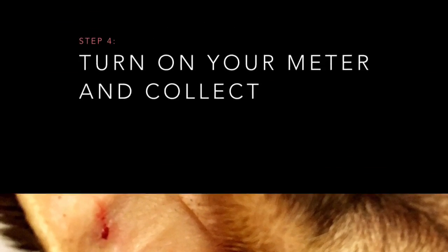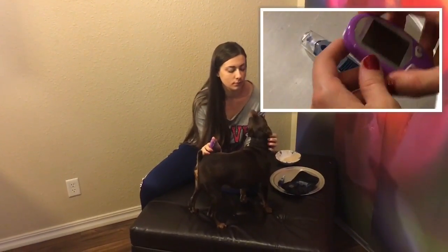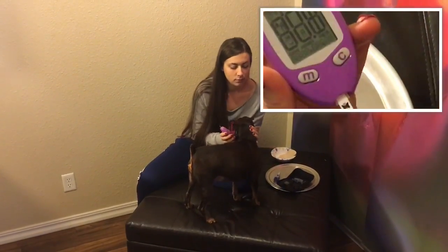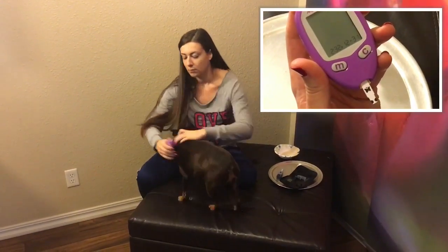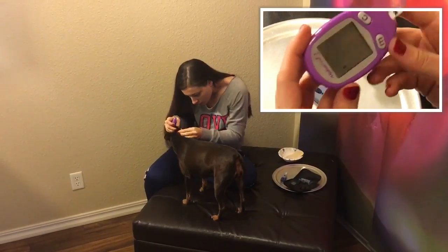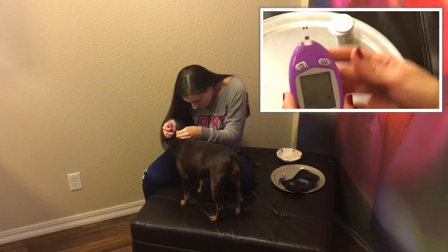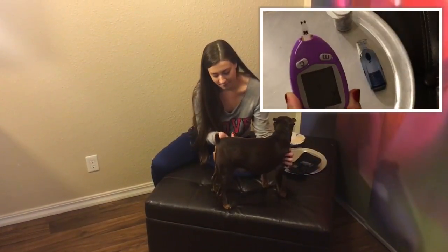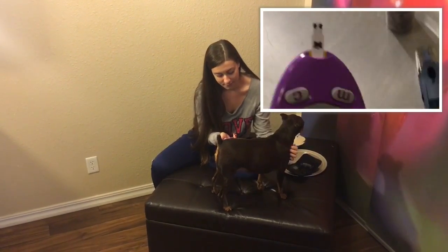Sometimes the blood doesn't show up right away, and it takes about 15 to 20 seconds. When you think you have enough for a sample, push your test strip into your prepared meter all the way, make sure the number is the right number again, and then you have about two minutes to collect the blood. Look for the little prongs on the side of your test strip — that's what you want to touch the blood to. The more accuracy you have, the less blood you're actually going to have to use to get your result.